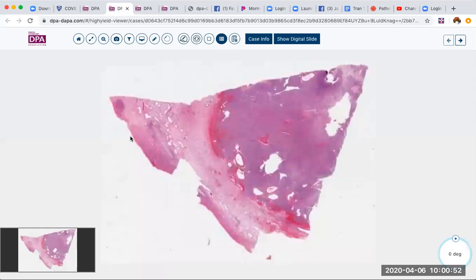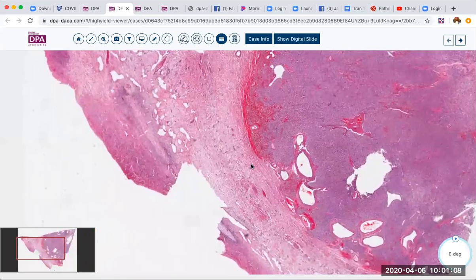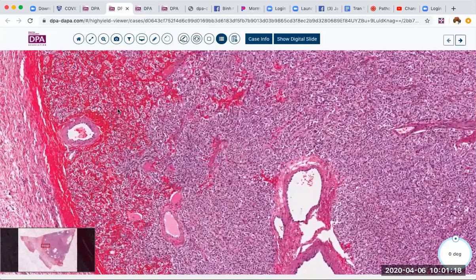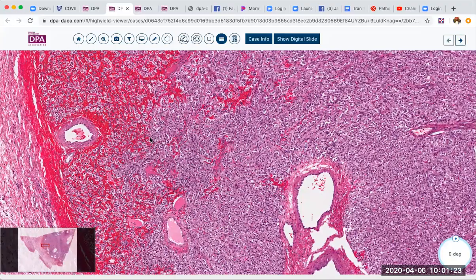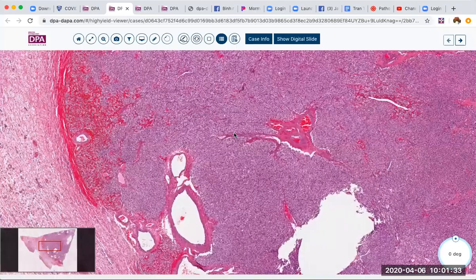Here's a nice section of this tumor. At low power, we have a little bit of ovarian structure out here and what looks like the neoplasm here. Going to higher magnification, we can see that this is quite a vascular tumor with some large vessels and a lot of very congested small vessels. This illustrates the packeted nature of this tumor. At low power, we didn't see any evidence of necrosis.